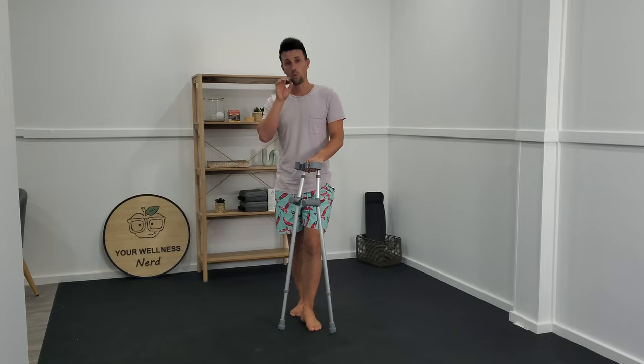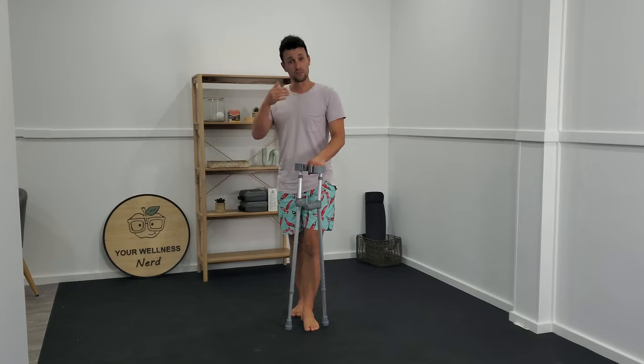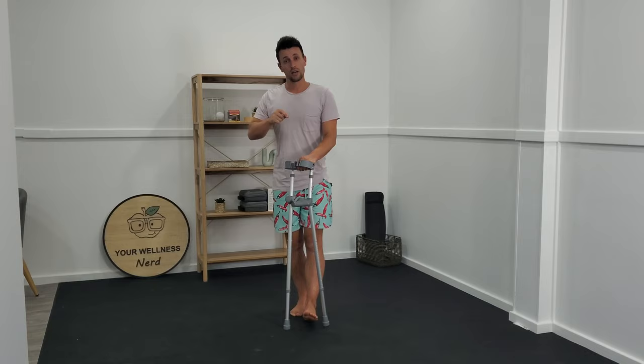For me as a physiotherapist who's big on education, the single most important piece of information you need to know about anything crutch or stick related is the purpose of why you're using it in the first place. The reason why we have crutches is to help unload an area that can't tolerate normal loading on its own, whether that's because of an injury, damage, wear and tear, or strength. The crutch or stick is there to absorb the force that you don't naturally feel comfortable putting through your tissue, because this drives your progress.